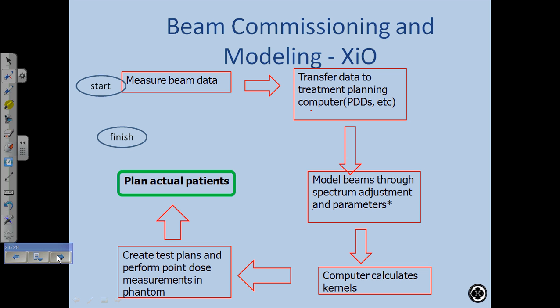Okay, so you're going to model the beam spectra, as I said. You're going to model the beam intensity variation across the field. Okay, so in other words, you're not going to model it, but it's going to use the convolution equation. The only part of the beam data that it uses, that you've measured, is the fluence. So different beams will have, the horns will look a little different. Okay, so it uses that initial fluence to model the beam.